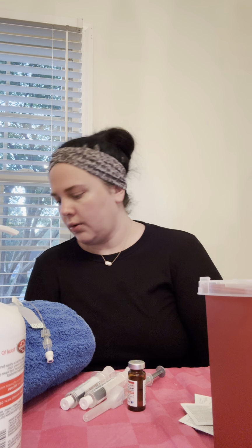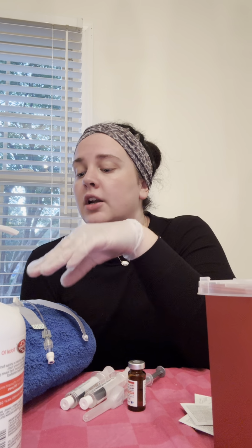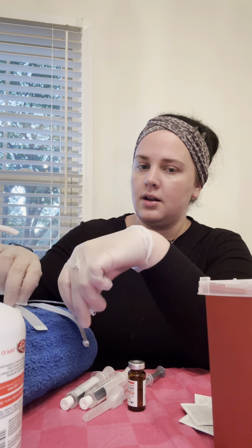Before I did anything excessive with the patient, I would re-verify her name and date of birth. She tells me her name is Renee Adams, date of birth 5/25/78, and I'll just re-verify that while looking at her wristband, because I am going to come over here and check the IV site for redness, swelling, infiltration, make sure that the site is still good and accessible, in which it is. So at this point, go ahead, unclamp that, and get everything ready.